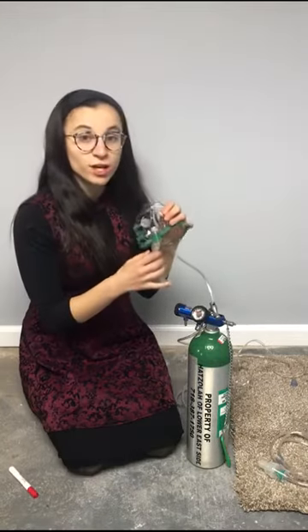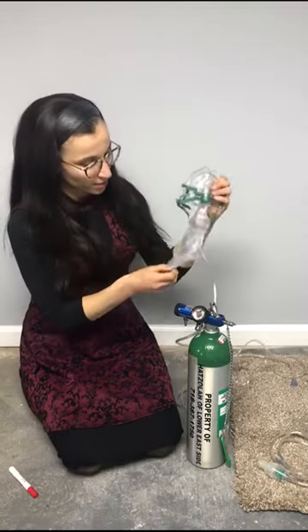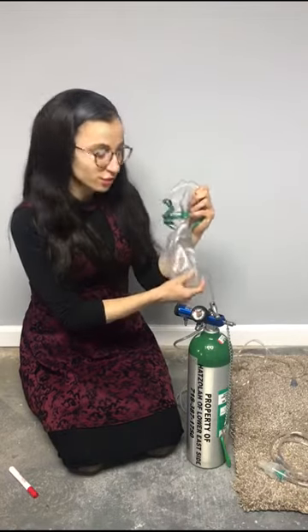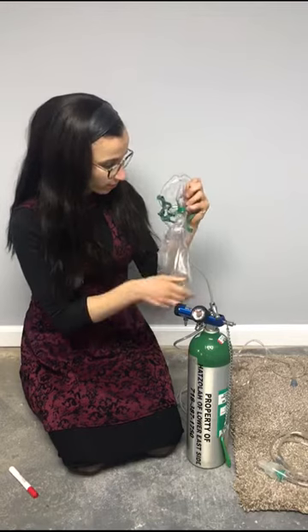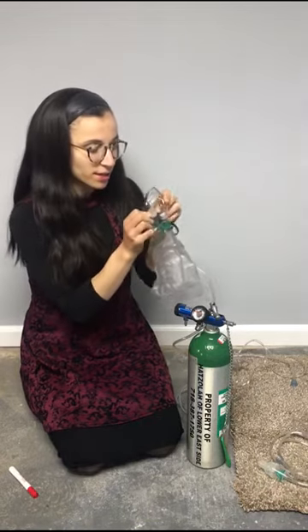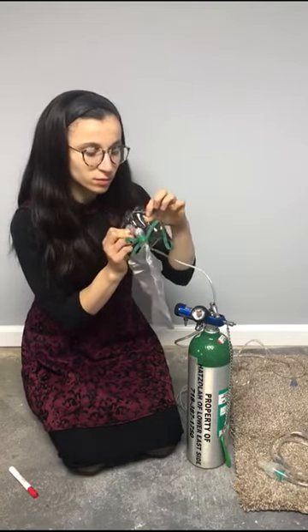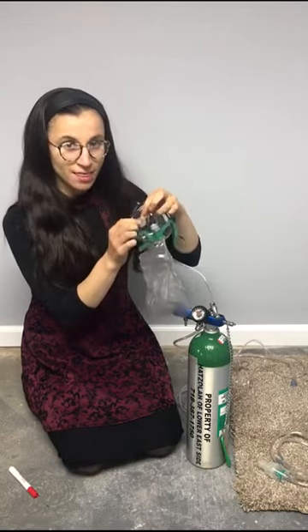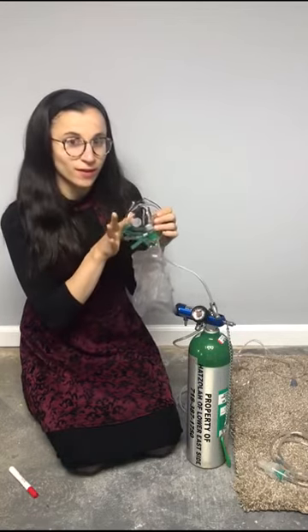So this is a non-rebreather. We see there's a bag over here. It's called a reservoir. You're going to fill it up with air first. Then, you see over here, this little port. You're going to close it. See, it's closed over here. And it's a one-way valve.